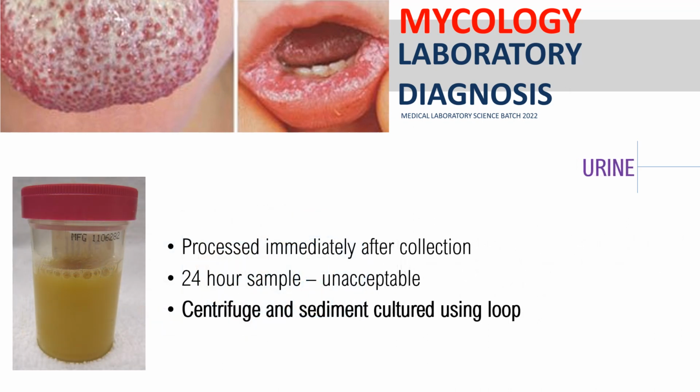Next, class, is you have your urine. For urine sample, it should be processed immediately after collection. Okay? Tapos, class, paki-take note, paki-highlight na lang din, class, that unacceptable ang 24-hour urine.